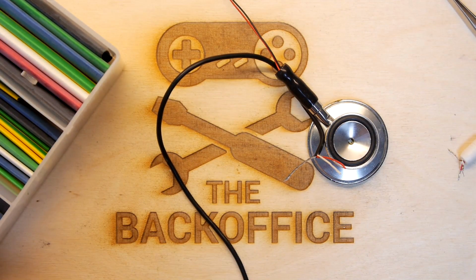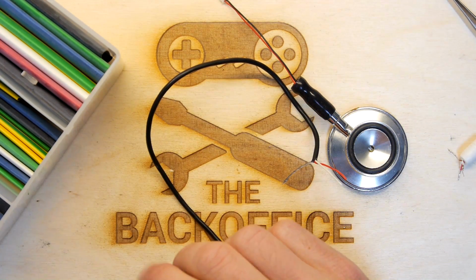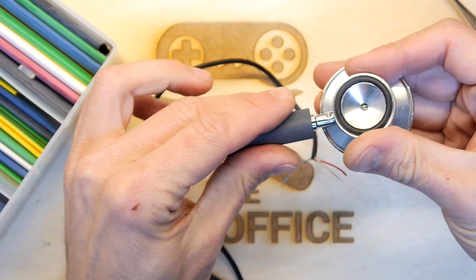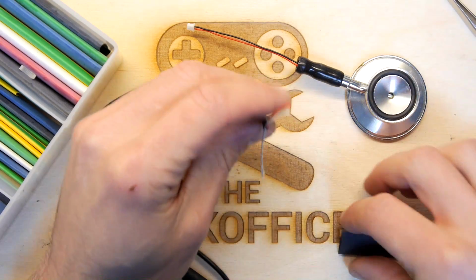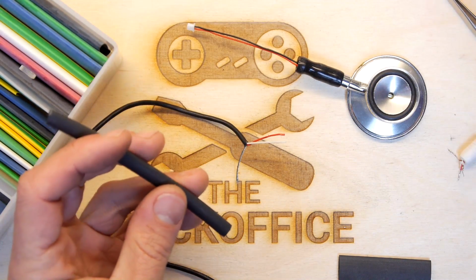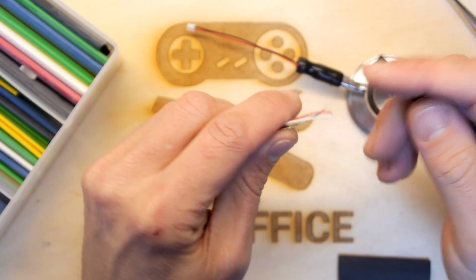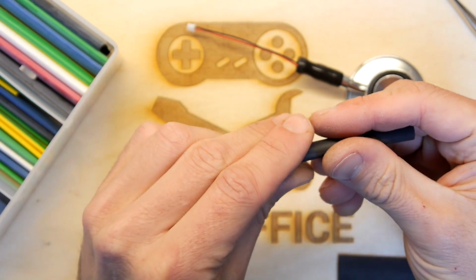But the best way of buying heat shrink, by the way, is to go on eBay and then you can get it in a big old box of various sizes and shapes and colors and things like that. So I'm going to choose out a nice big bit there. That's going to go over the lot when I'm done, but that's not going to really provide any strain relief. So I'm going to use a much smaller one for the strain relief. And we're going to cut, I don't know, whatever. That's like 2 inches worth. I think that should be enough. Just going to feed that through.